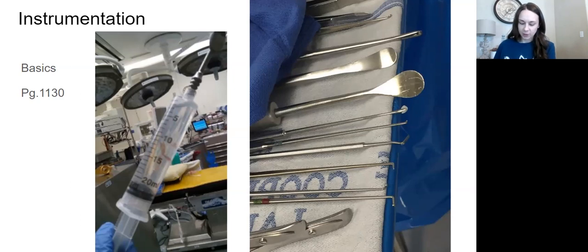Okay, as we keep going, periosteal elevators. Let me move my face over here a little bit. Periosteal elevators. So there's one right here, actually, but you know what elevators look like. So there's lots of different kinds, but if it looks something similar to a Freer elevator or a key elevator, then it's still an elevator. It's going to be used to elevate bone or periosteum.